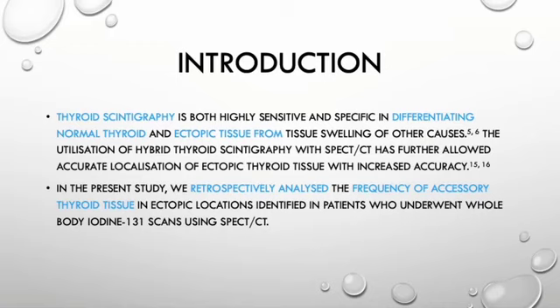This is because with thyroid scintigraphy we use radioactive iodine, which localizes more sensitively and specifically to thyroid tissue, since it's taken up by thyroid tissue.